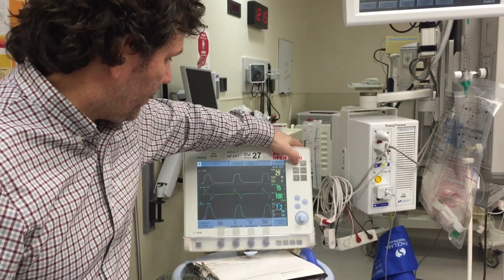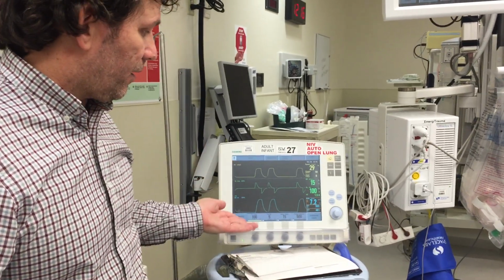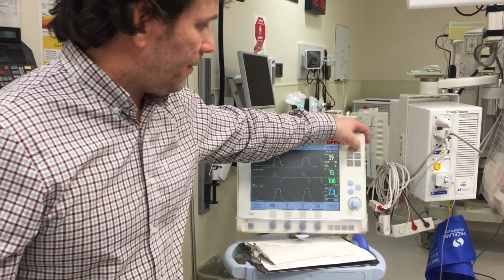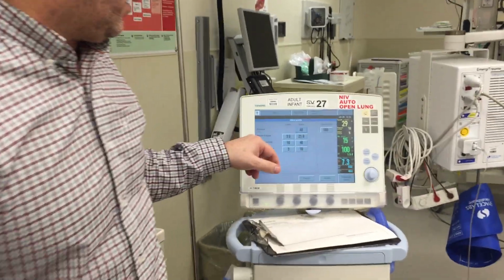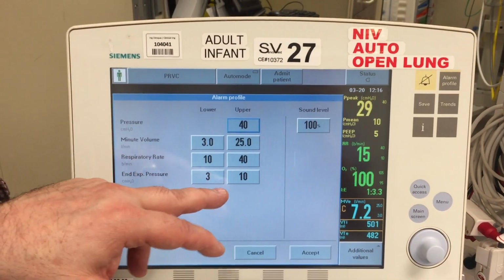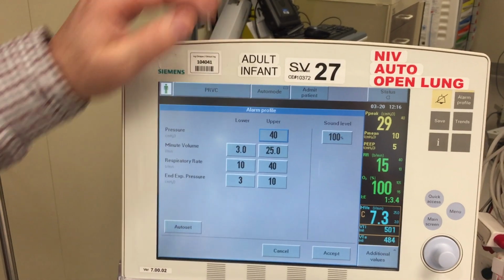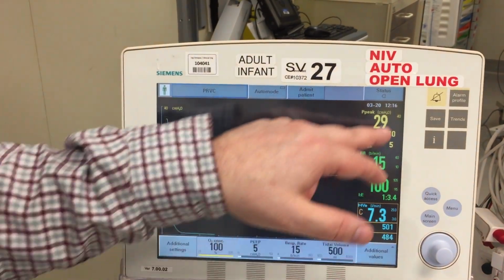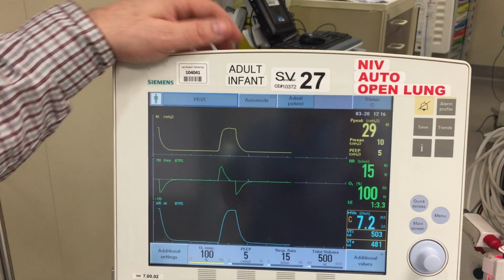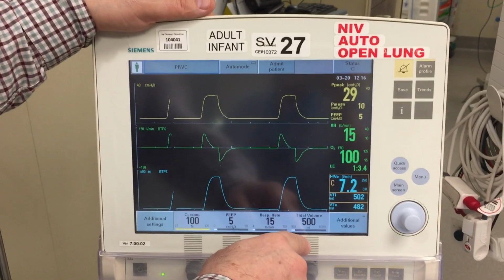To clear the alarms, we just have to hit the alarm button twice. Now our screen is clear. We don't have to worry about it. We will quickly check out our alarms. So we go to alarm profile, and we have our pressure, our minute volume alarms, respiratory rate alarms, and our PEEP alarms. And our pressure, if we compare it to PEEP, or our PIPs rather, peak inspiratory pressures, which is 29 in this case, that's fine, because that's what was needed to achieve that tidal volume of 500.